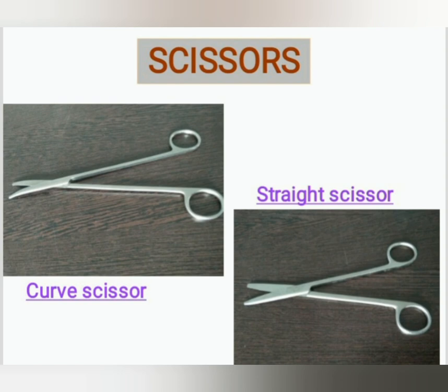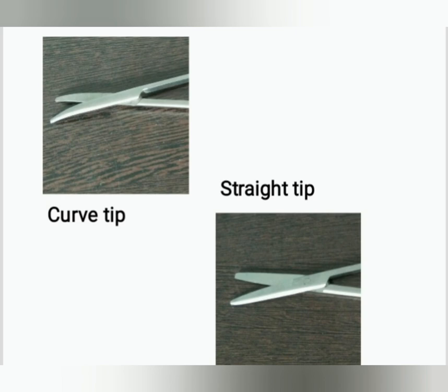The second most common instrument is the scissor. There are many types of scissors available in hospital, like small, medium, and large size scissors, and curved and straight scissors. Today we will discuss about curved and straight scissors. The main difference is that curved scissors have a curved tip and straight scissors have a straight tip, and straight scissors have a sharper blade compared to curved scissors.